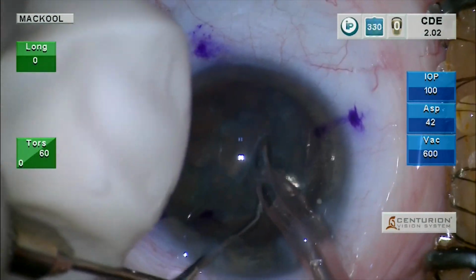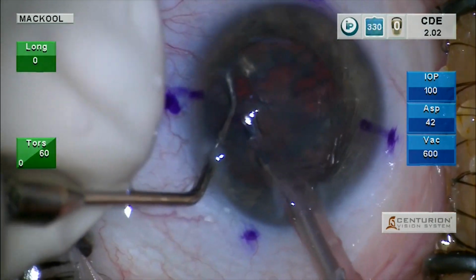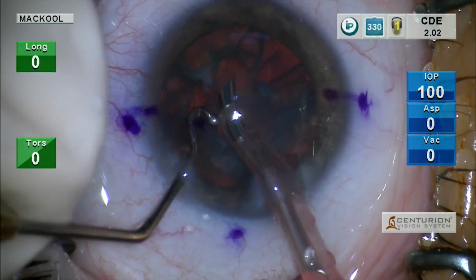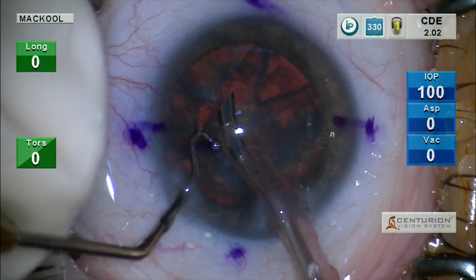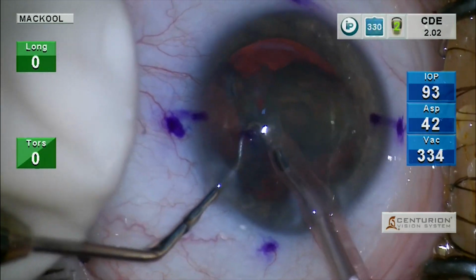And so far I have. So let's now rotate this next segment and attract it with high flow. Notice I didn't actually go to touch it. I didn't have to.